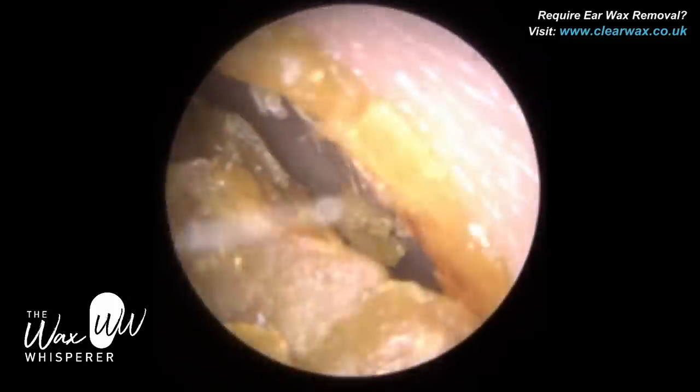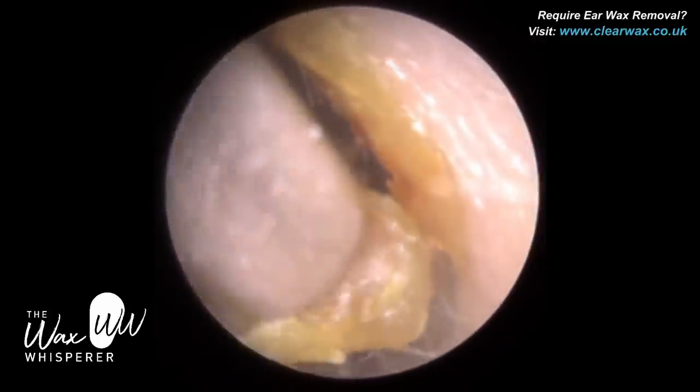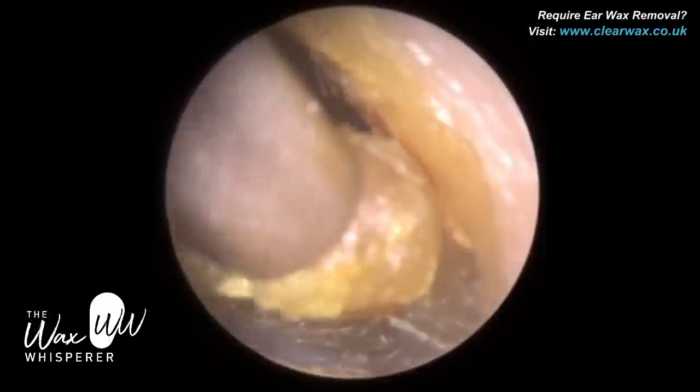I have a client today who attended with bilateral, fully occluding, very dry earwax — dry hard earwax — and we're starting in the right ear first.